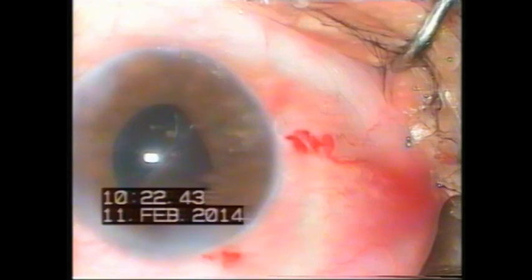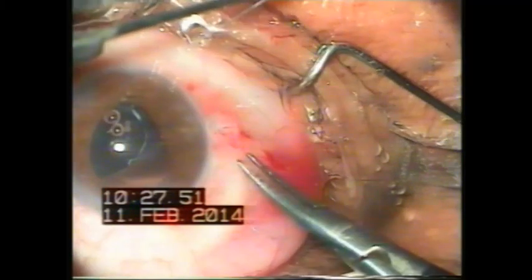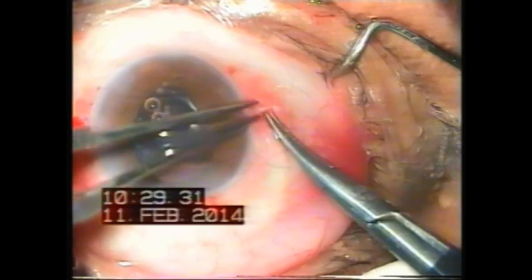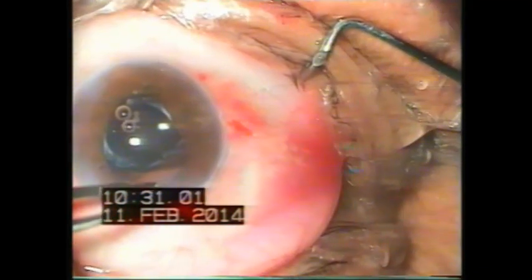Second fixation site was fashioned 180 degrees apart. Similar procedure was repeated with other pole of haptic bag complex. Haptic bag complex was dialed in position at ciliary sulcus by applying gentle traction on the sutures. The fixation suture ends were tied to each other and cut ends buried inside the scleral tunnel.